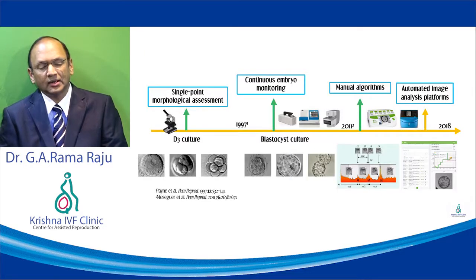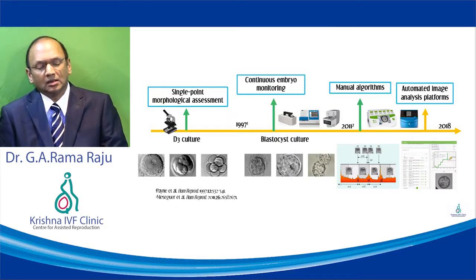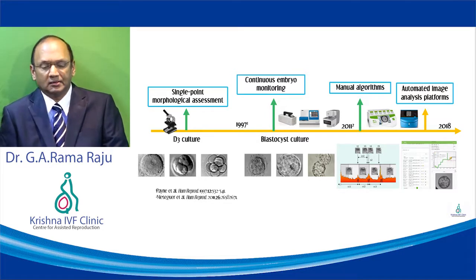In summary, time-lapse technology before 1997 was a single point morphological assessment, wherein the inverted microscope was kept in the incubator and then monitored.